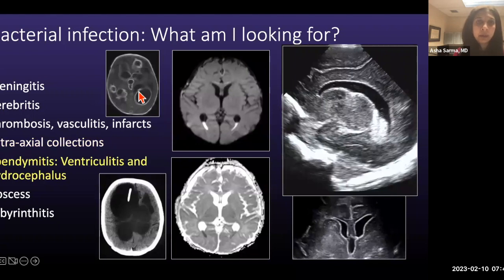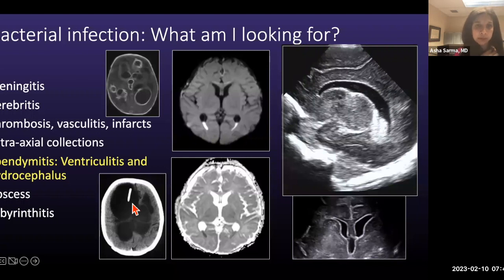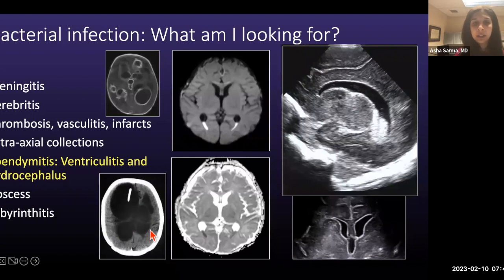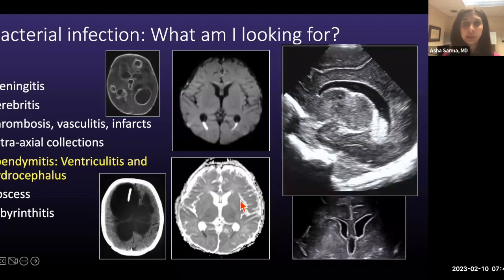Ependymitis — ependymal inflammation can lead to hydrocephalus. Here's a patient with very severe ependymitis forming walled-off cysts within the ventricular system that may not communicate with one another, making neurosurgical management very complex. When doing follow-up, it's important to evaluate all areas separately. Another finding to look for is pus within the ventricles — seen very well on DWI as low diffusivity layering within the occipital horns of the lateral ventricles. These may be tiny dots, but always look for them. On ultrasound, you may see ependymal hyperechogenicity and pus or low-level echoes layering within the ventricles.